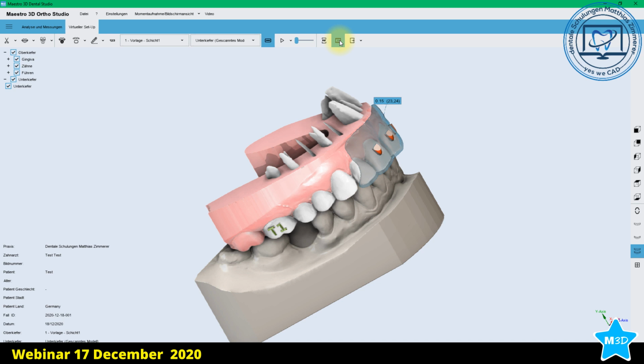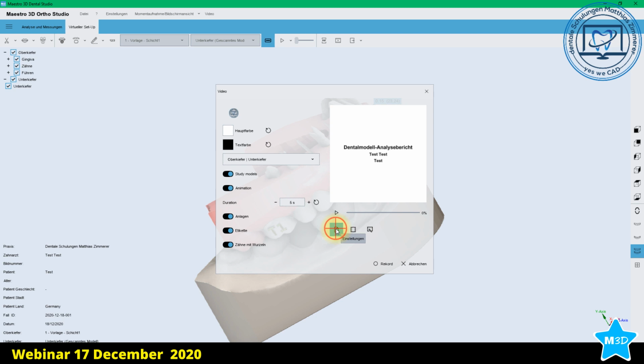You can make a short film. Yes, you can change the logo, the colors, the animation. How long would be the duration of the animation? What format would it be? Just set up the name of the film. It isn't necessary to have HD quality for just looking at it on a smartphone from the dentist, or just for sending to the patient.